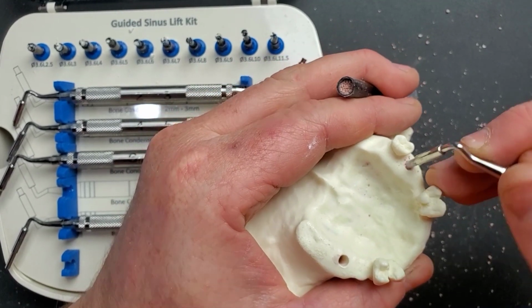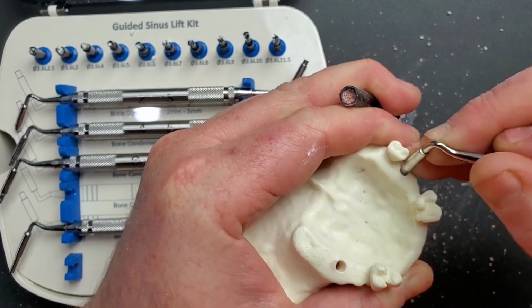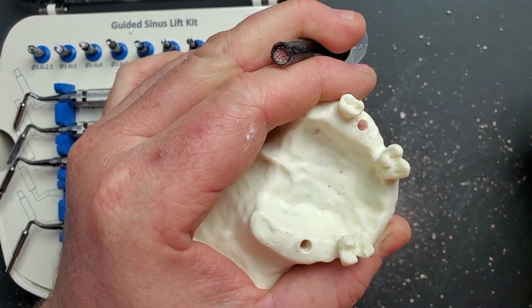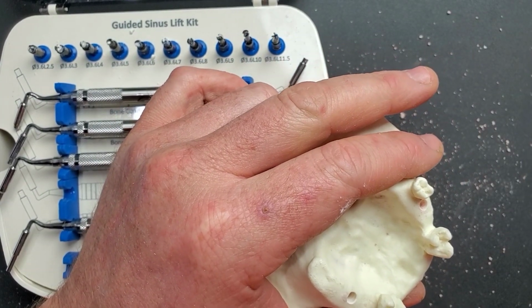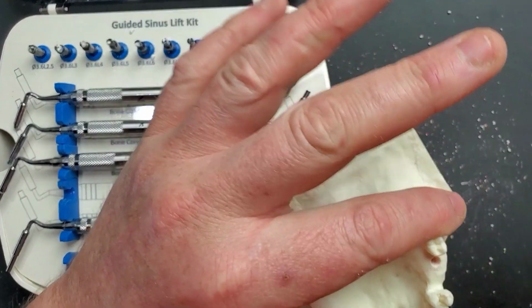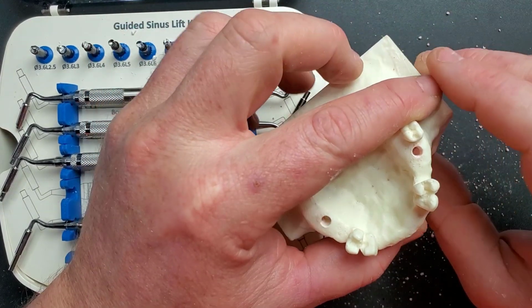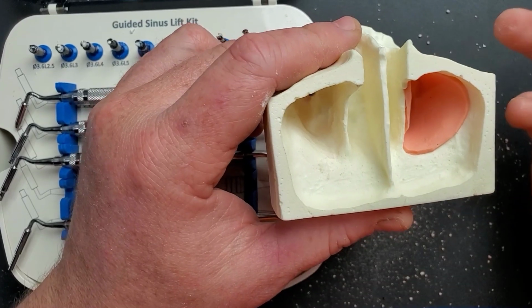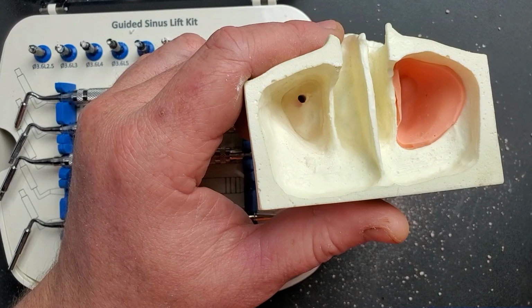If this were on a clinical patient, I would take a PA at this point and see how much of a lift I've got. And what you're looking for is a nice rounded dome of bone. If you look in there and you see on your PA that it looks like there's not a dome being created, or if you see a small dome but it almost looks like smoke coming out of a chimney, if that's happening, then you might have caused a perforation, in which case it's good to abort at that point, close up, come back and try again in another 8 weeks.